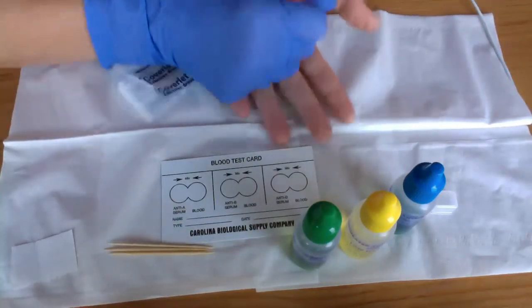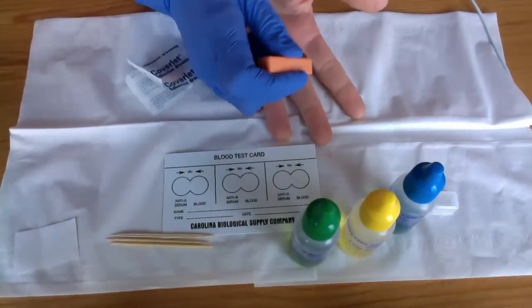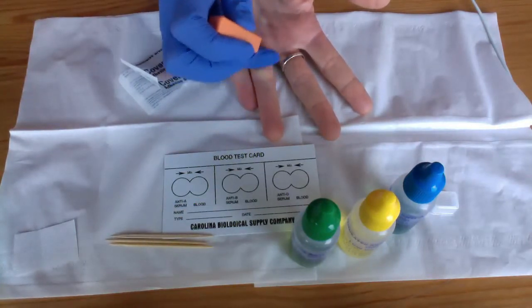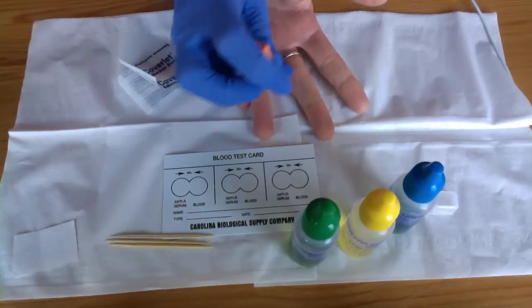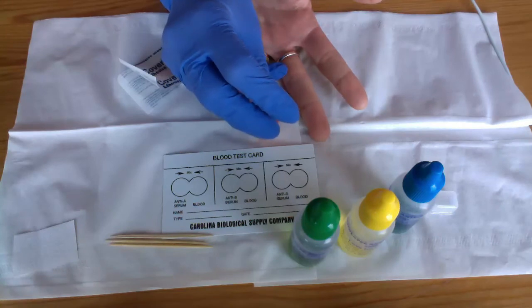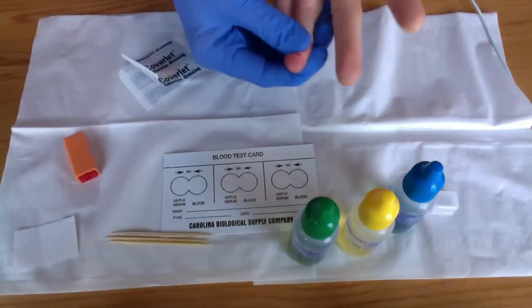So what you want to do is put your hand down and put your pinky finger and your ring finger on the finger, especially on your proximal phalanx on that ring finger. You can hold it down, and then you're just going to push on the side of your ring finger. Okay, you're just going to push down. And then the tough part for me is you have to milk it.